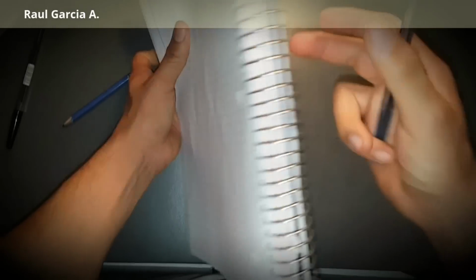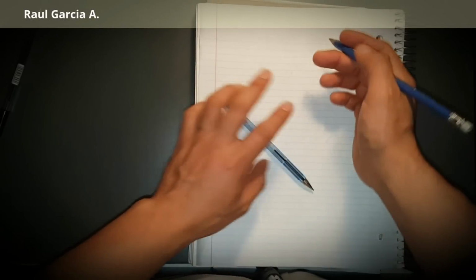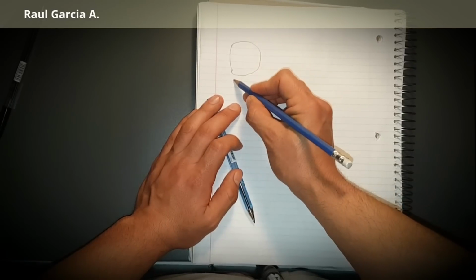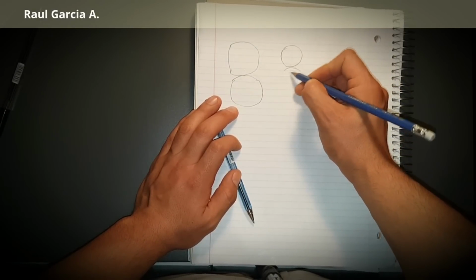Now, let's see another one. Let's see what happens when we talk about an embrasure clasp, which is another type. We're just going to keep it simple to the most important ones. Usually we use it between molars, okay? Or we can use it also between a premolar and a molar.